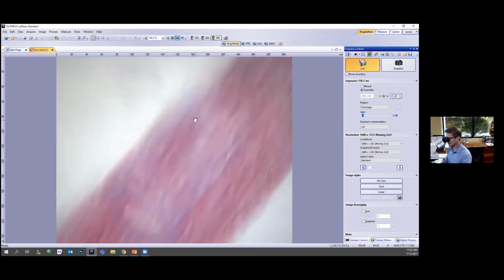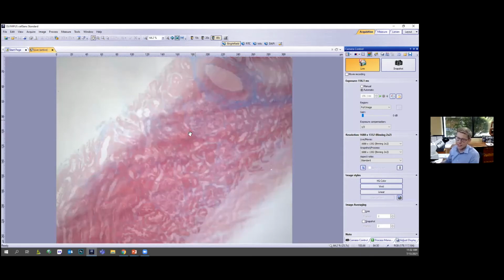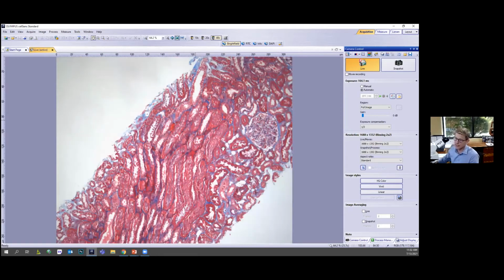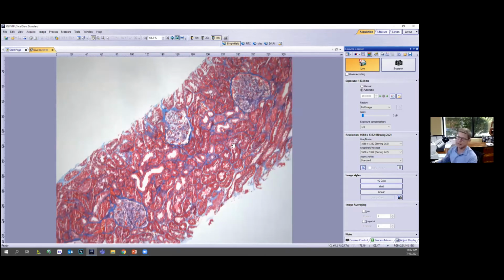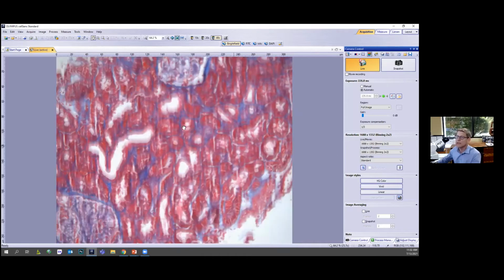If we examine it on a trichrome stain, and we always stain these kidneys with multiple stains, we can assess whether or not there is scarring in this kidney. I've already told you this is a normal kidney. So the tubules in this case are exactly like they're supposed to be. They're back to back to back. There's virtually no intervening space between the tubules.